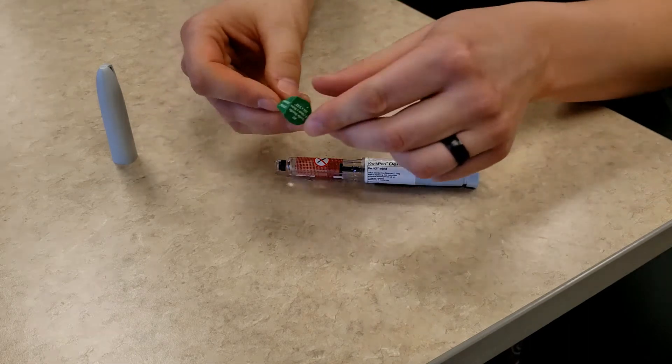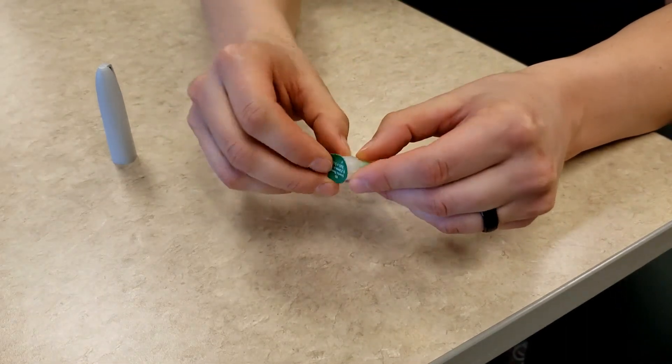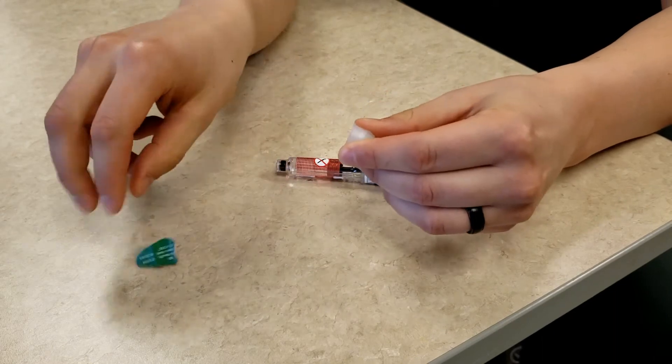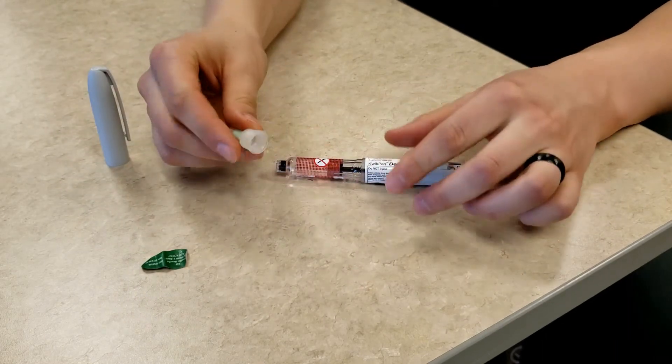Next, you will take your pen needle and remove the paper tab. Then, press the pen needle onto the insulin pen and screw it into place.